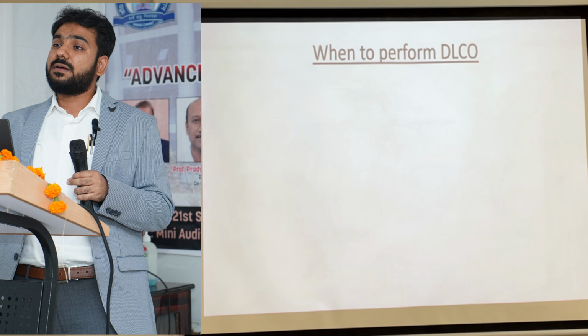Now one of the common concepts that we have is we associate DLCO with ILD. At least I used to do during my MD days, especially whenever a patient of ILD comes, then only we used to think about DLCO. That DLCO is related to ILD. Whenever we see ILD, we will order DLCO. That was the only thing that we used to think about. DLCO is associated with ILD, but it gives us so much more information.